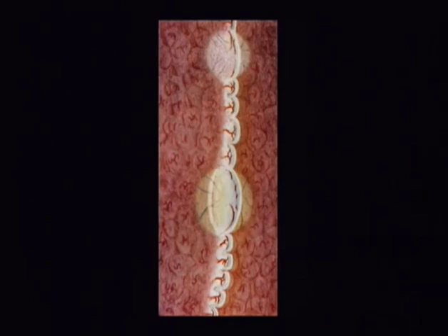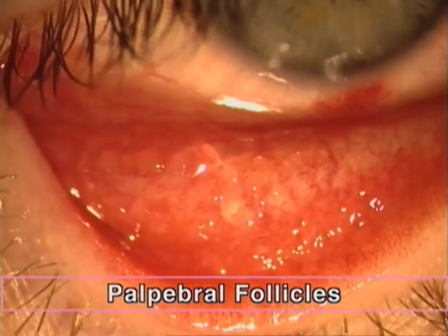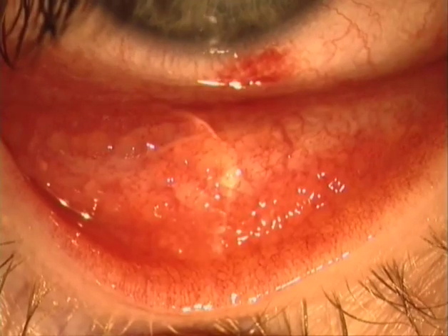To compare, in the papillae it is the central core which contains vessels, and the homogeneous tissue is at the periphery. Thus, the position of the vessels allows us to distinguish between the papillae, which are developing along pre-formed capillaries, and in which the capillaries are central and deeply buried, and follicles, which are accumulations in between the vessels, and in which the capillaries are peripheral and superficial. Follicles can best develop to their full size in the orbital conjunctiva, as here in the lower lid.